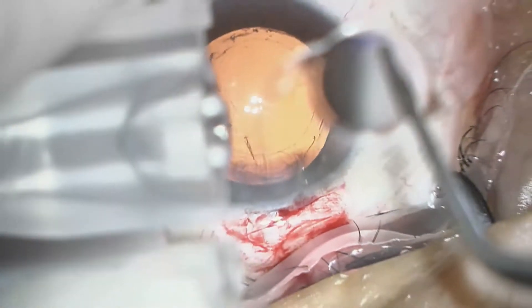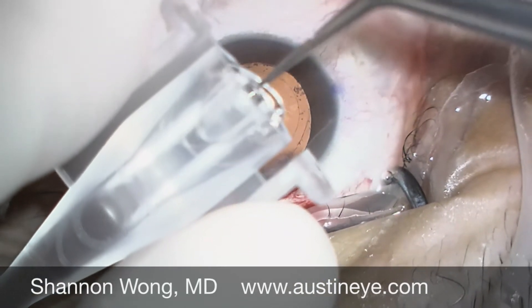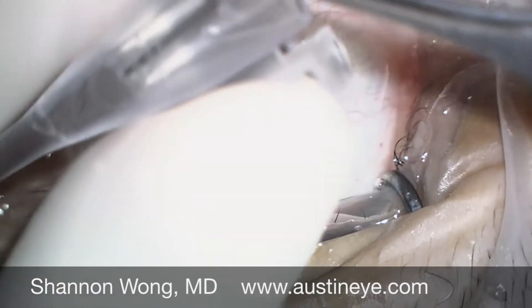Here we're loading the toric lens implant into the insertion cartridge. The leading haptic is in proper position. The trailing haptic also is in proper position.